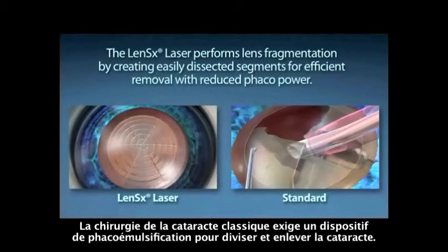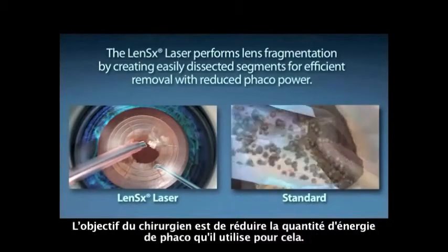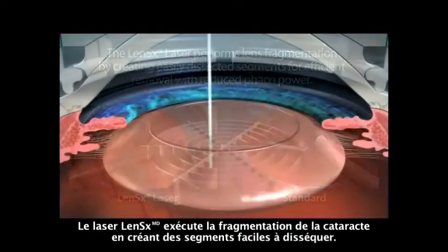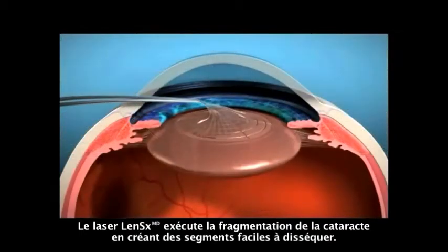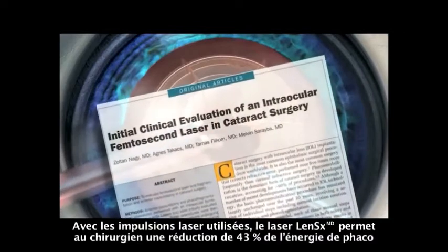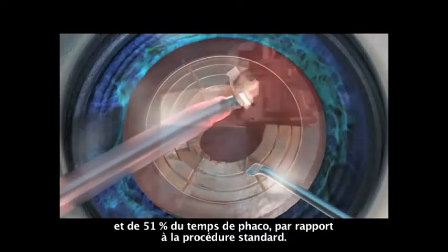Standard cataract surgery requires a phacoemulsification machine to segment and remove the content of the cataract. The goal of your surgeon is to reduce the amount of phaco energy used to remove your cataract. The LensX laser performs lens fragmentation, creating easily dissected segments for efficient removal with little or no phaco power. With the laser pulses utilized, the LensX laser provides the surgeon a 43% reduction in phaco power and 51% reduction in phaco time compared to the standard cataract procedure.